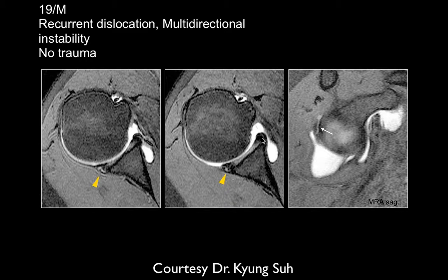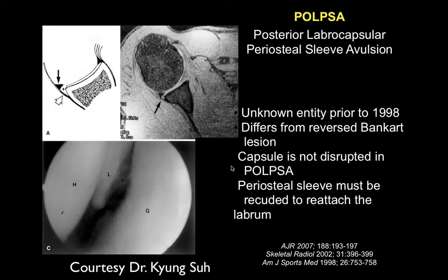Yeah, in this case, the axillary nerve, because it's in the distribution of the axillary nerve. And then here's just another posterior labral tear. I've seen plenty of these again. And you can get tears of the posterior capsular attachment.